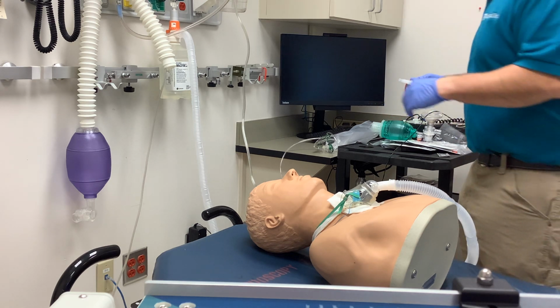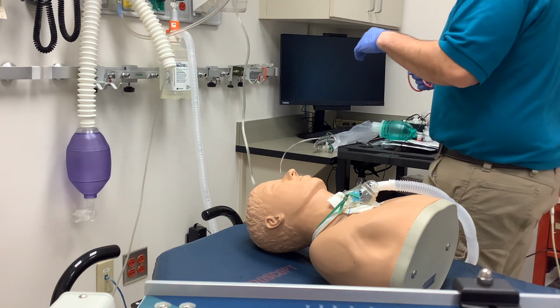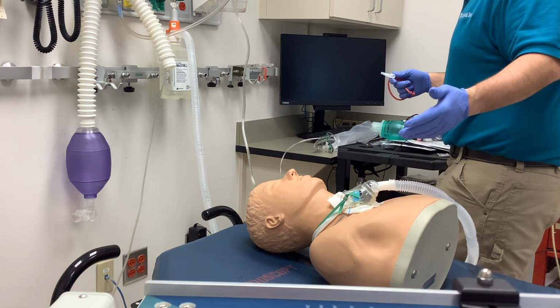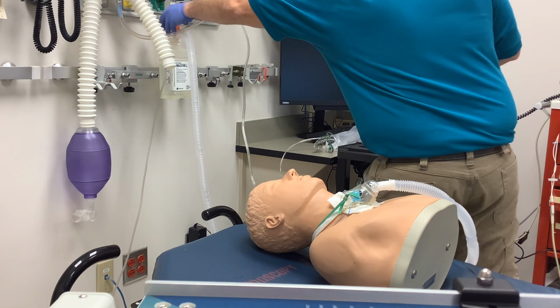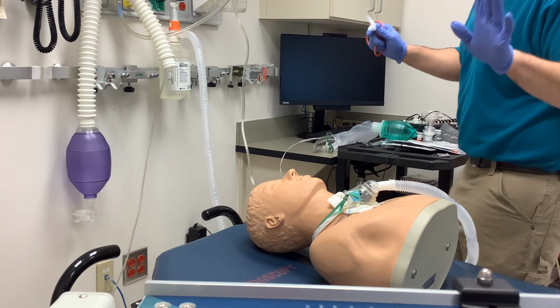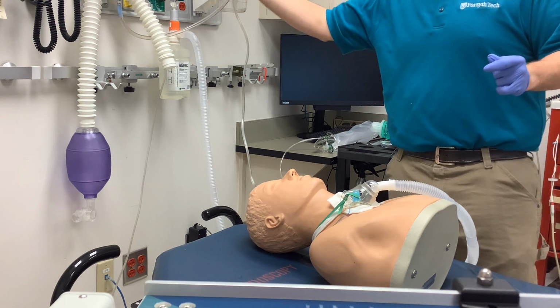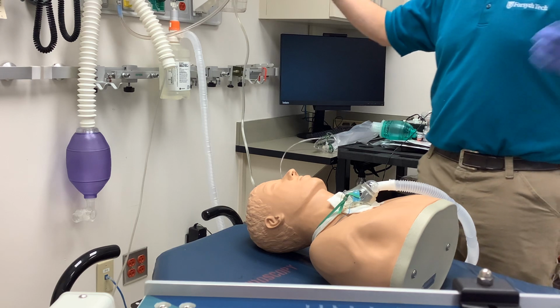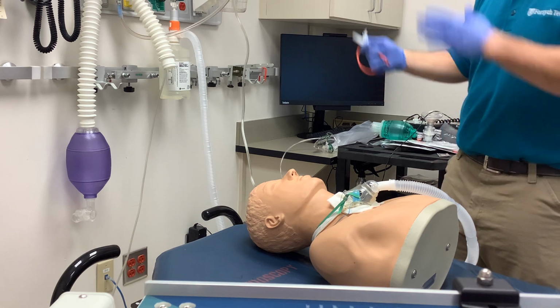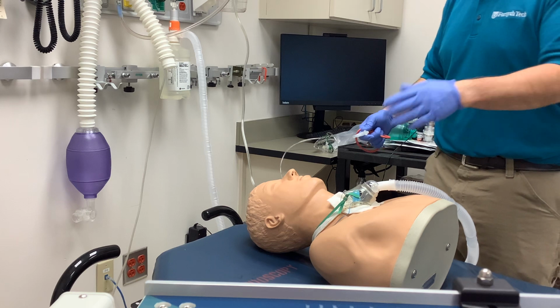So you can do that. If you wanted to manually ventilate with a bag valve mask, you can do that. Or you've got the trach collar, the tracheostomy collar, on the patient already. You can turn this collar to 100%, and that'll hyperoxygenate your patient. That being said, though, we started off with our air to oxygen entrainment ratios. Understand that whatever liter flow this is at, so if it's at 10 and you turn this to 100%, there's no longer any room air being entrained in that system. So it's just going to be 10 liters of 100% oxygen that comes through this tracheostomy collar for this patient.